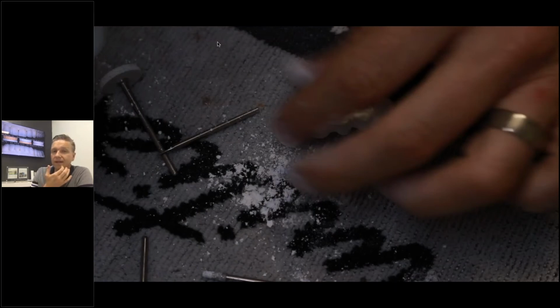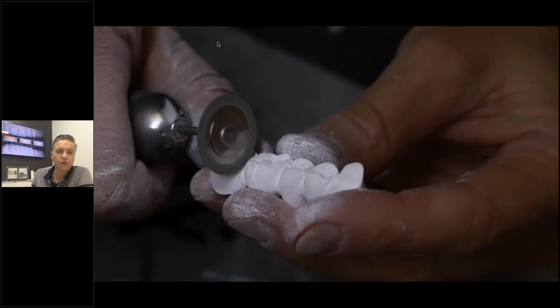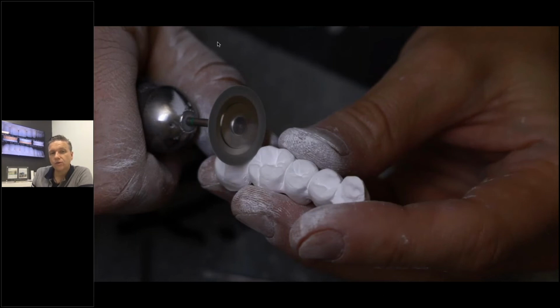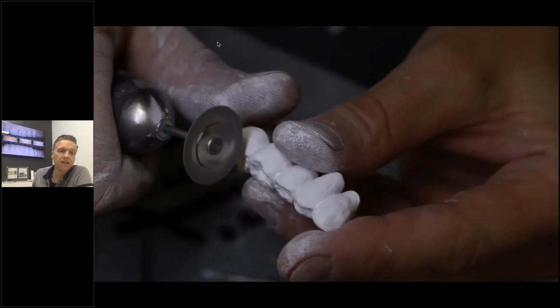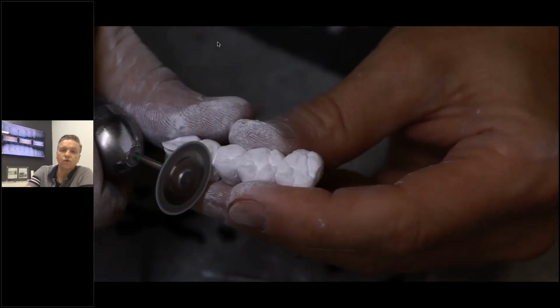I usually use a rubber disc, diamond infiltrated, or a very thin diamond disc, just to open embrasures a little bit more, to shape it here and there, even to make an imperfection if I want to, just to avoid that it looks too perfect.